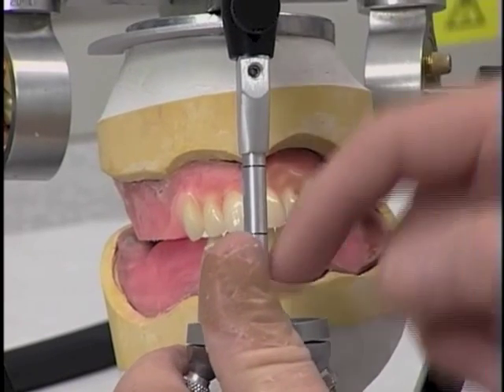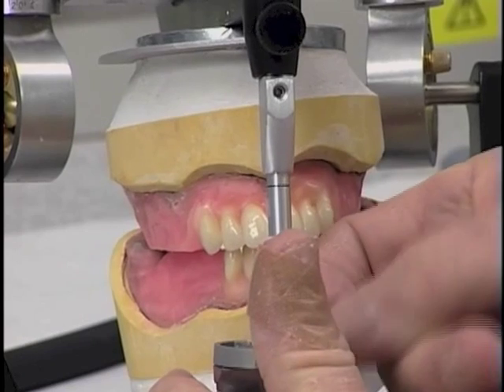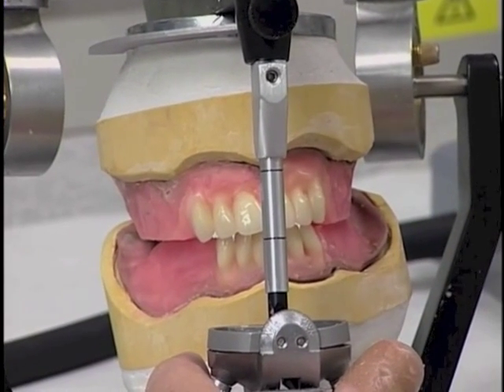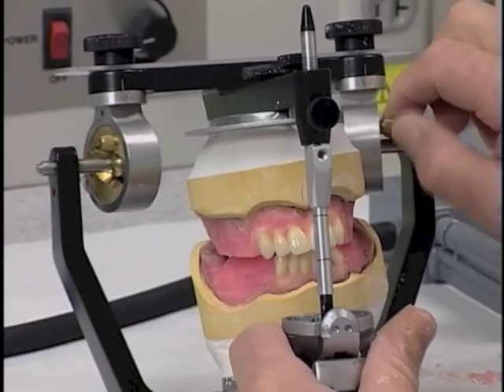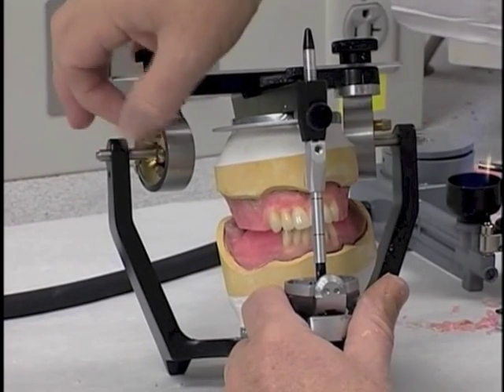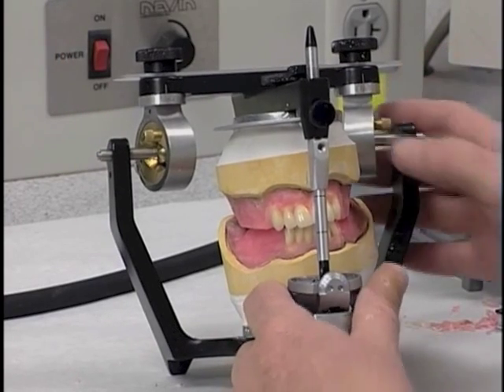What we can do at this point is we can adjust our incisal guide table in such a manner to protect those anterior teeth as we go into protrusive or right or left working relation. So let's loosen the condyles now. Loosen the condyles on the articulator and get them to the point to where they move freely.